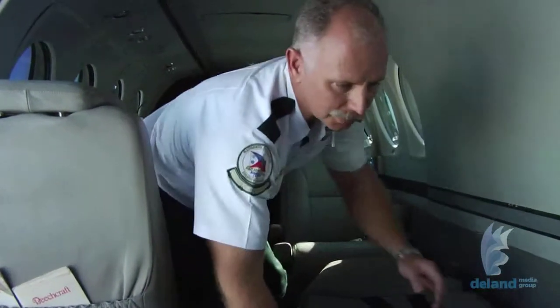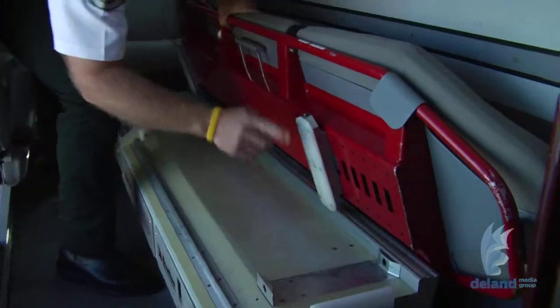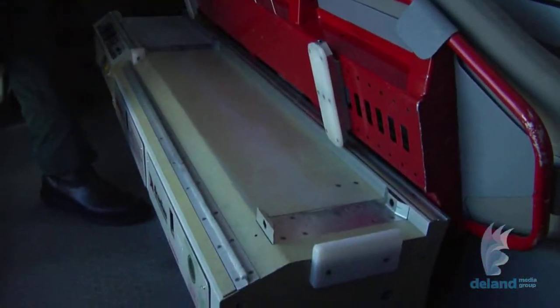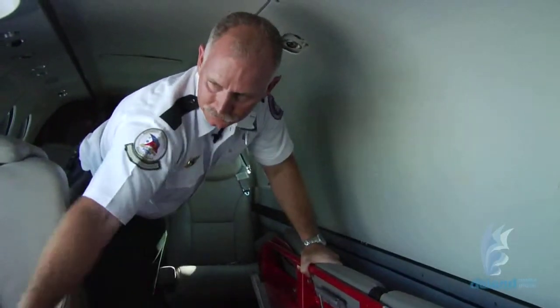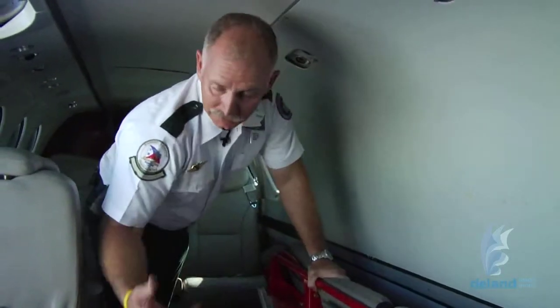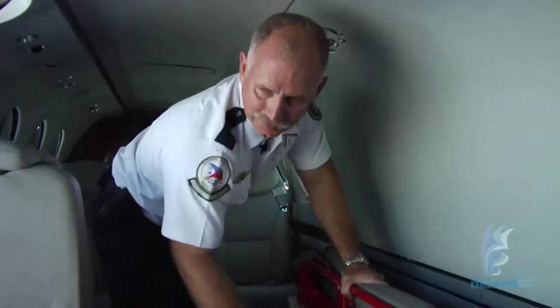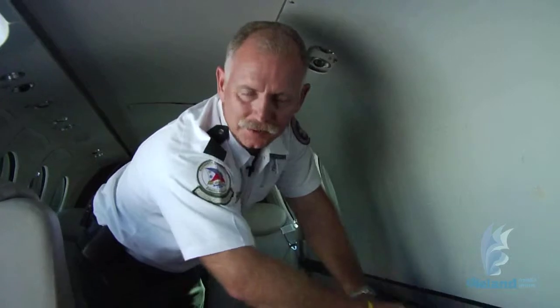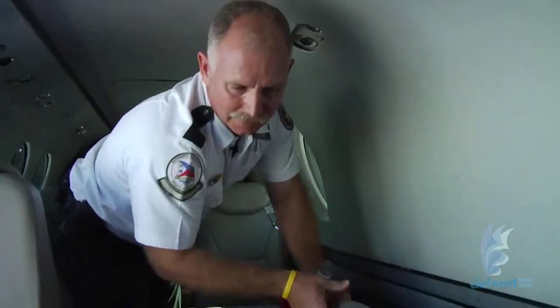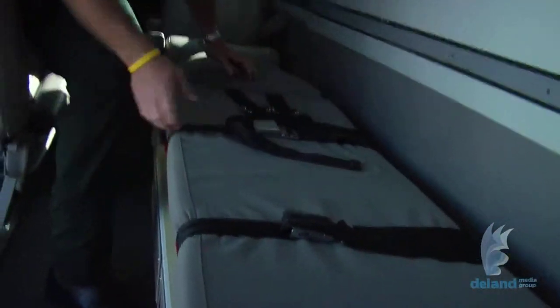And the stretcher itself is actually very nimble. As you can see, it locks into place on these little pegs, each one of the feet, and that's what allows it to slide in and out on the ramp. We also have what we call a clip deck, which we attach to the ambulance stretcher, and these feet lock into place on that clip deck the same way they lock in on here. And that allows us to take this stretcher to the hospital, put the patient on this stretcher. They stay on the same stretcher the whole time. And then once we get it back in here, we would slide it in, get it in place, and then lock it in place. And now it's secured.